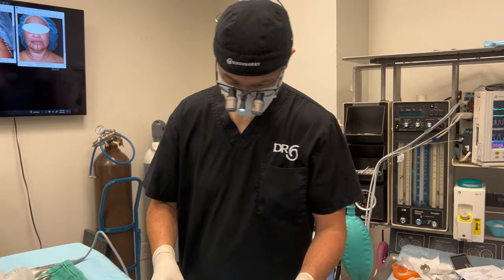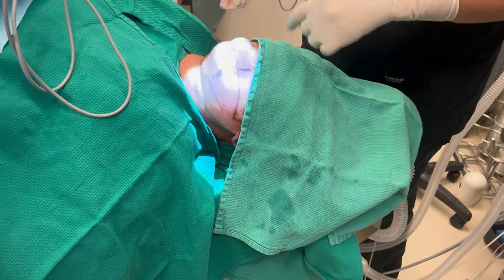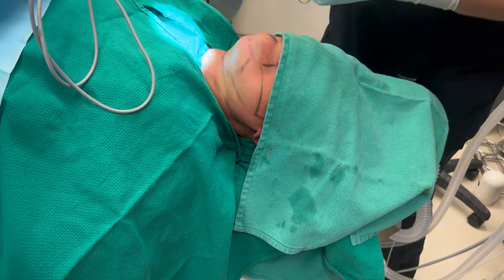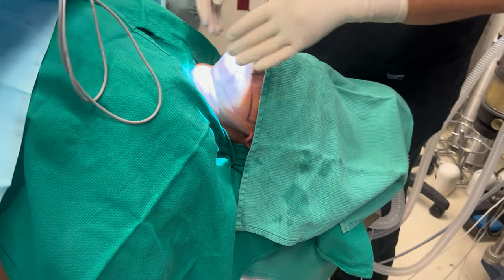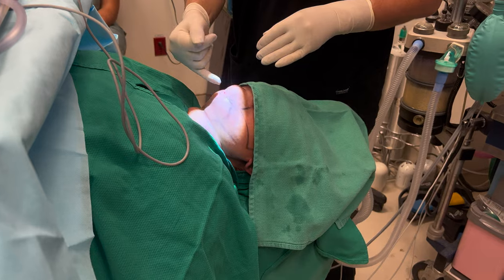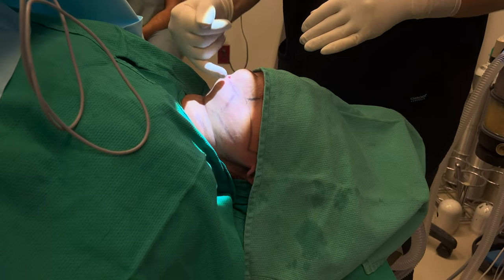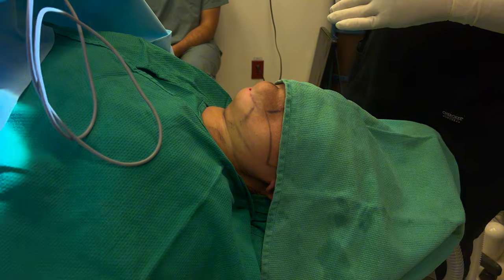The first step was to inject the tumescence — that's a local anesthetic and epinephrine. Even with just the local anesthetic, it makes it easier so when she wakes up she's going to have less pain in her neck. We're going to give it a couple minutes to work. I'm going to make a little incision, first liposuction these areas, and then open up and go into the deep plane of the neck.